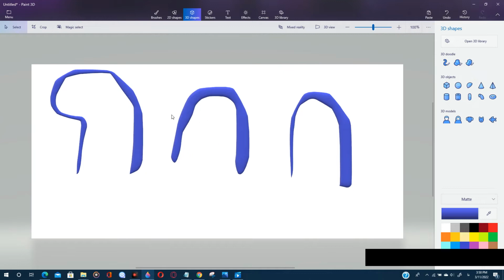This is normal LV. This is hypokinesia. In the septum, we see a thin septum and low contraction of this wall. This wall is thickened, and this is thinner, and we see aneurysm in this item. It may make a clot in this region because the flow is very slow, as we see.